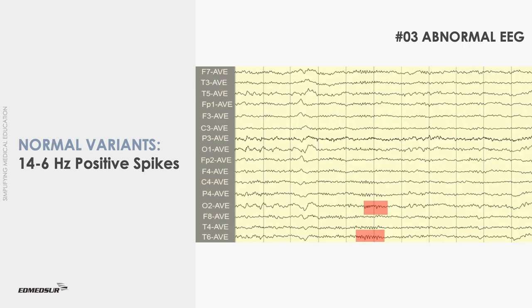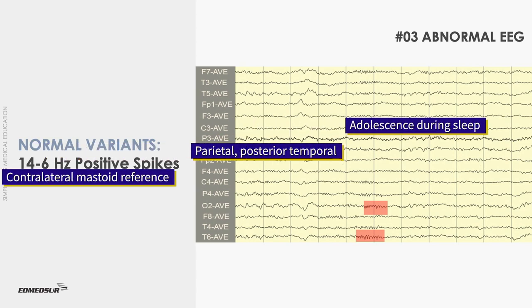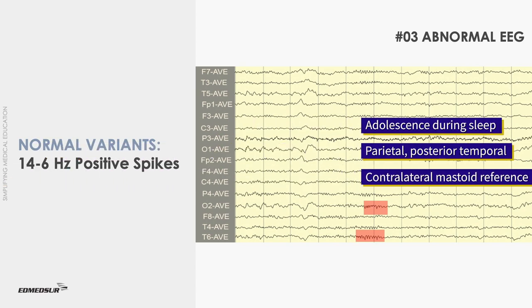14 and 6 Hz positive spikes are apiculate waveforms that usually last for about 1 second. The 14 Hz component is more commonly seen than the 6 Hz component, but both may occur simultaneously, as can be seen here. They are usually seen in adolescence during sleep, maximum in the parietal and posterior temporal region, and can be either bisynchronous or unilateral. They may be difficult to recognize in bipolar montages and are best seen in montages with long inter-electrode distances, like ear reference or contralateral mastoid reference montages.